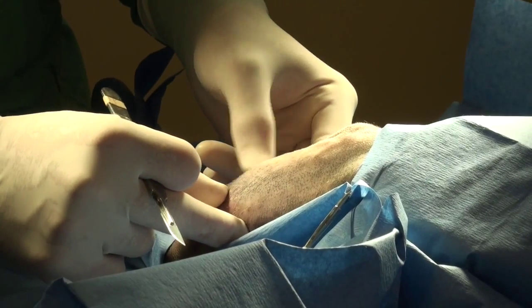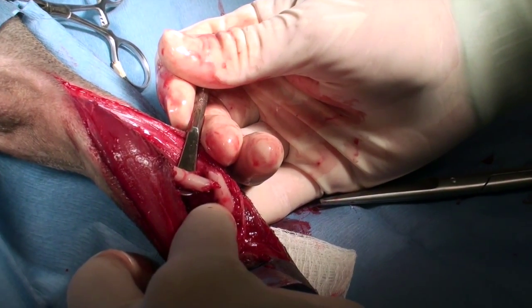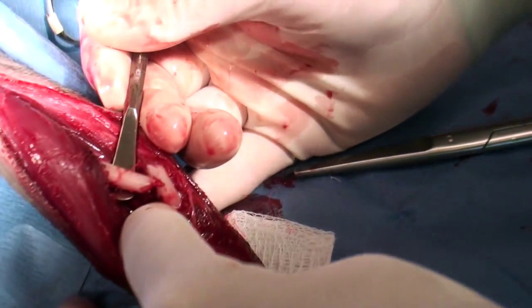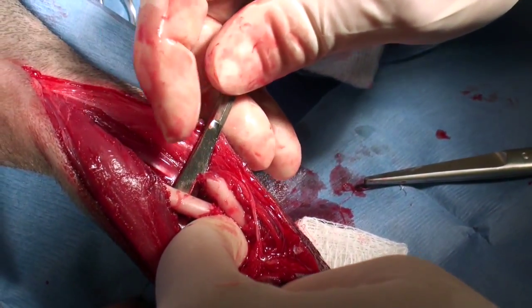You'll likely see a lot of blood, unfortunately. We have already exposed the fracture. There is some displacement of the part that's not really visible in the radiograph, but we can see it now and we'll have to do some correction.